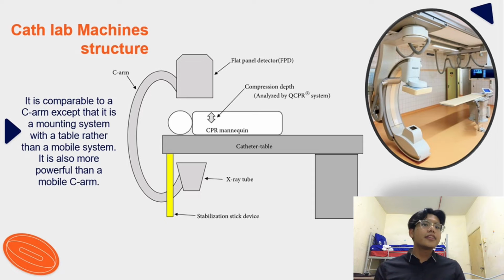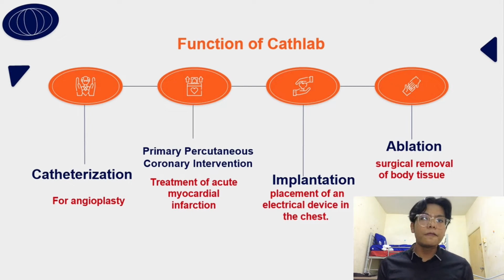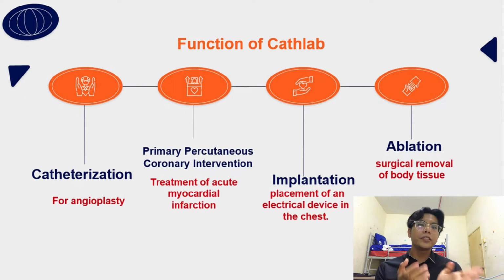Following that, I will explain about the function. The function is to visualize the movement of the contrast in the arteries, and the way to inject the contrast is the catheterization. That's why the full name is the catheterization laboratory. Catheterization is not only for diagnosis but also for treatment.